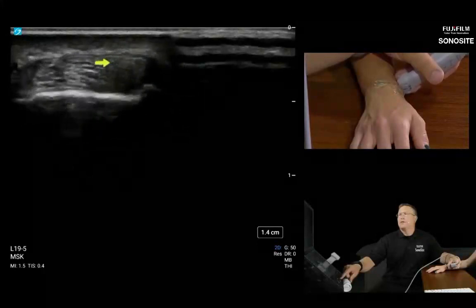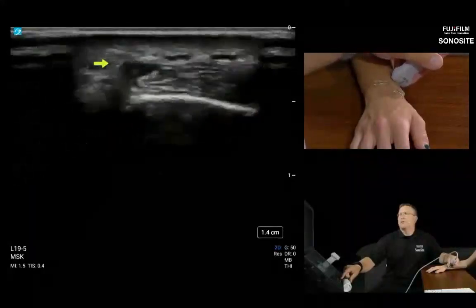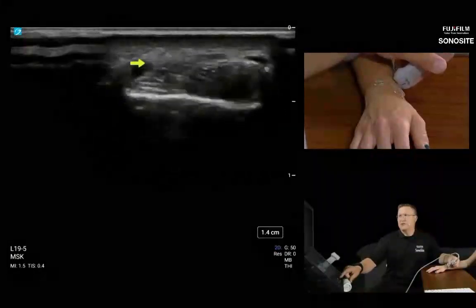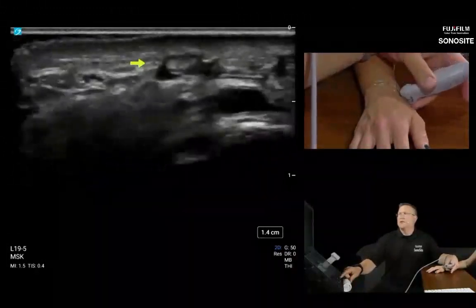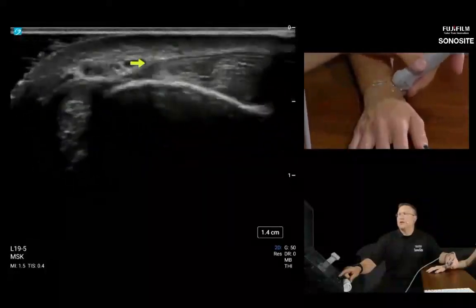And there it bifurcates again, but it rolled over compartment 1. So that's really important because it can also get smashed superficially here. Or if you've had a patient get blood gases lately, this is usually the nerve for an ABG that gets stuck and causes a lot of residual pain later.